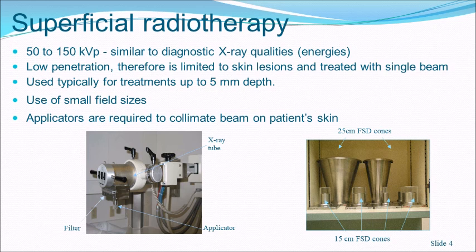Superficial radiotherapy is not popular in India because we don't see many skin lesions. However, this is being used in several countries, including UK and countries in Europe, Canada and USA. It's still very popular there, but we don't use it in India.